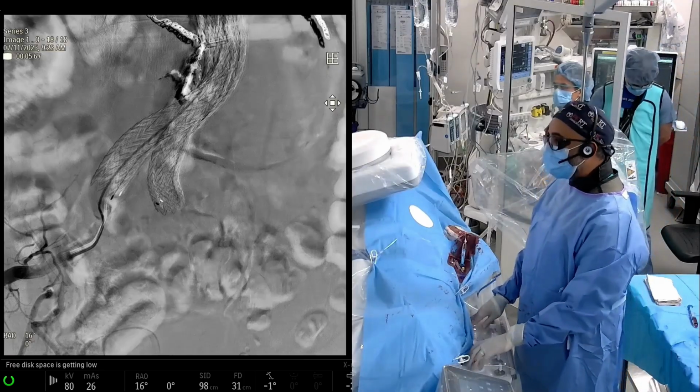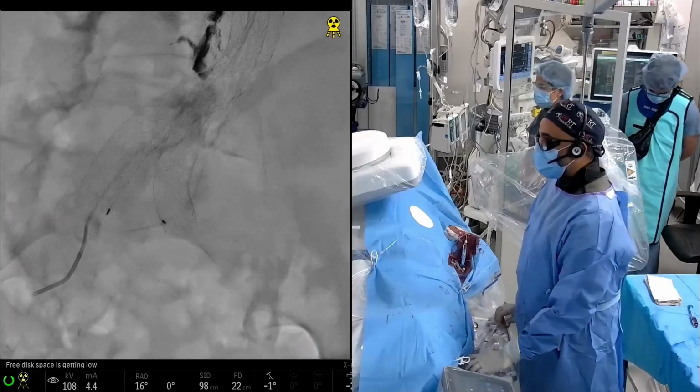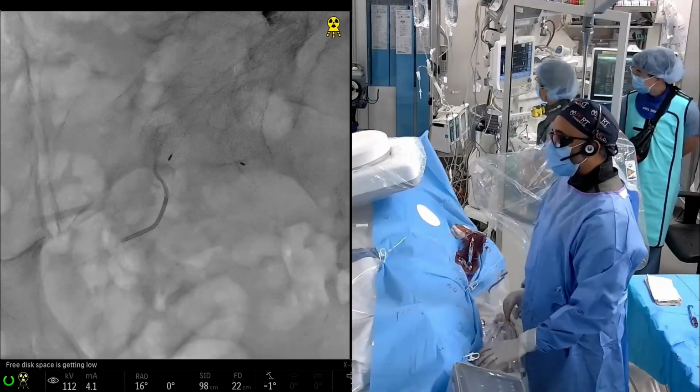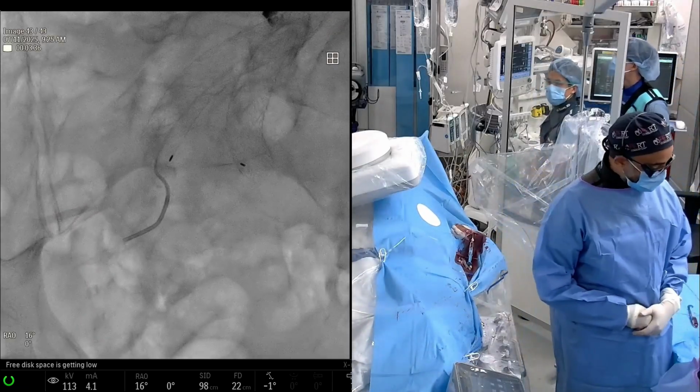It's really hard for me to shorten the coil. So we're going to try an 855 and see how it goes here. In reality, I'm hoping that it just takes one or two coils and we'll be done. And I think this is a good strategy.